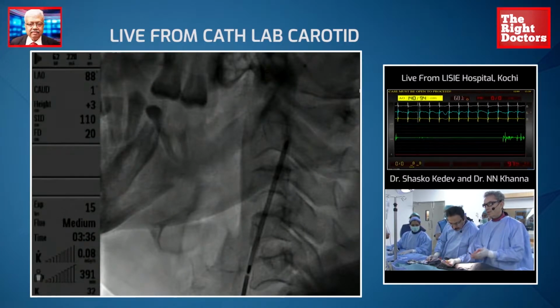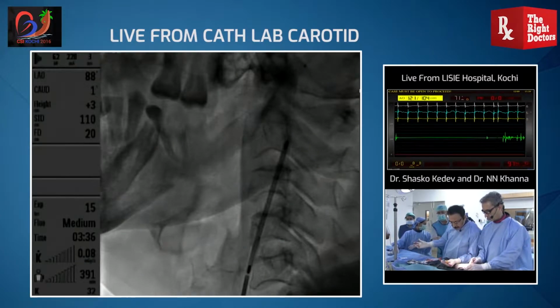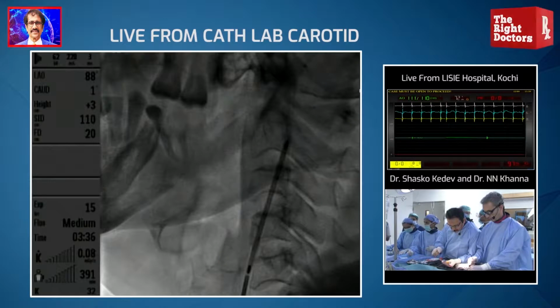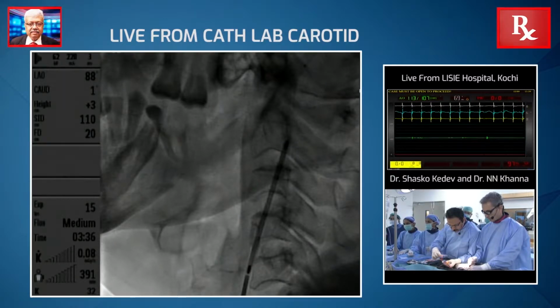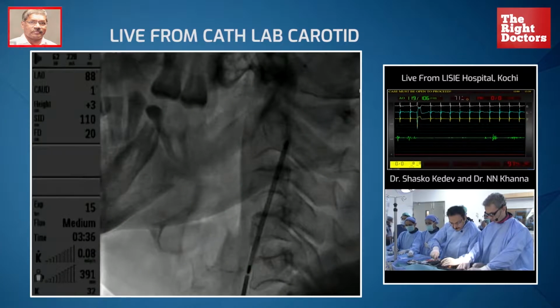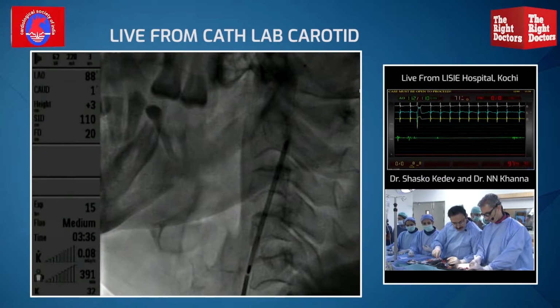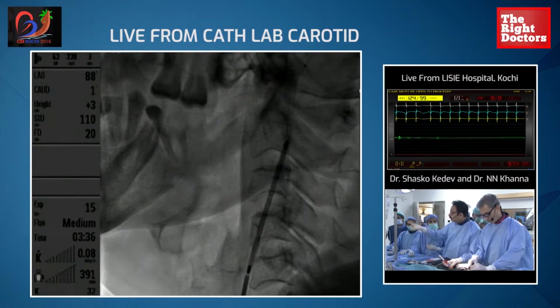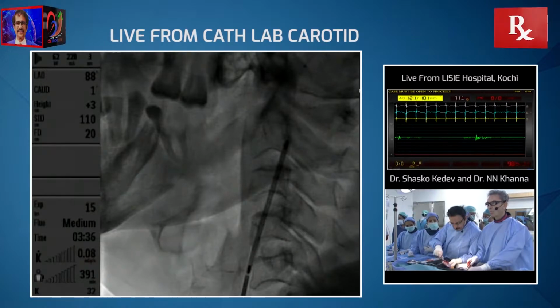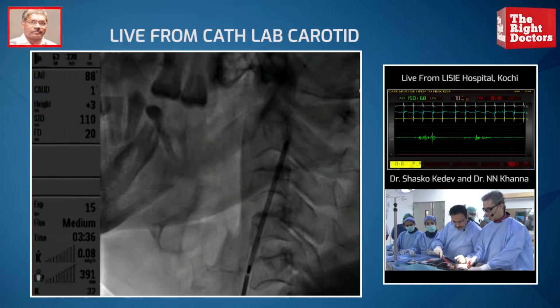What do you think about the indication of carotid stenting in this particular situation? Lower lock. Wait. Yes, yes. Let me fill up with no air. No, just a little bit from here, just to clear the air. Can we increase the volume? Closed? Yes. For what? I did not catch your point.